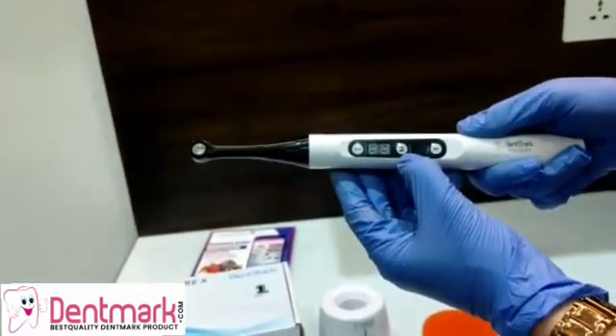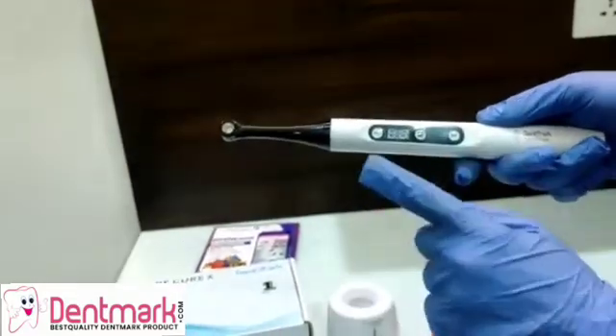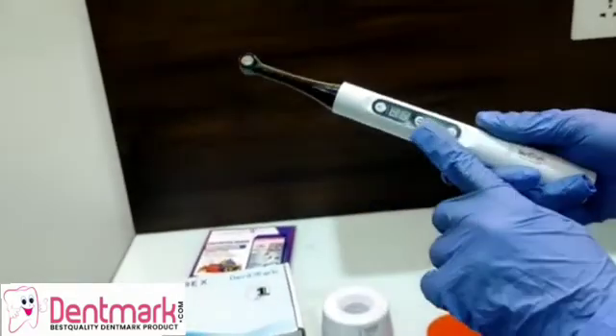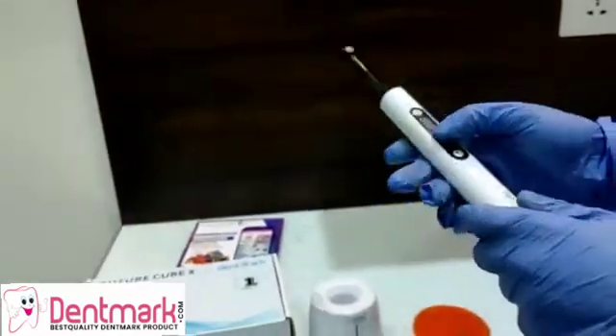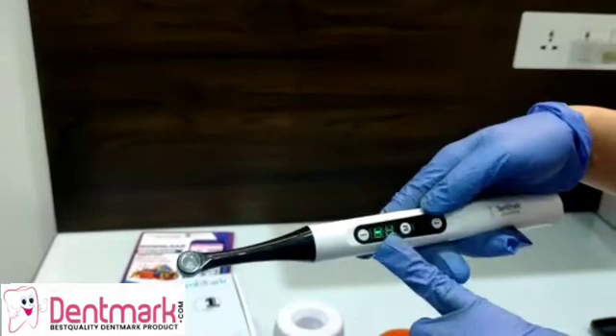This is the power button from where you can turn this machine on and off. These are the three modes from where you can operate it, and this is where you can set the timer. So there are three buttons in all.